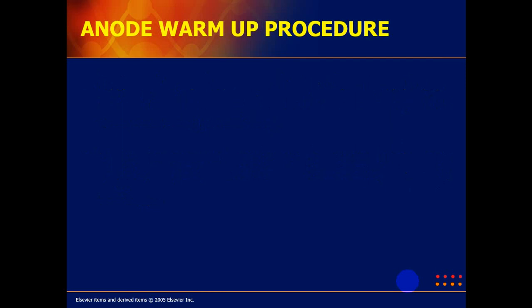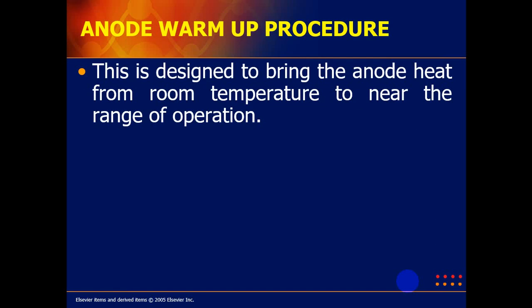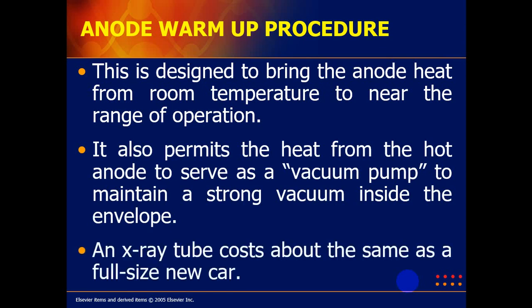So, we also have the anode warm-up procedure. This is designed to bring the anode heat from room temperature to near the range of operation. It also permits the heat from the hot anode to serve as a vacuum pump to maintain a strong vacuum inside the envelope. An X-ray tube costs about the same as a full-size new car.